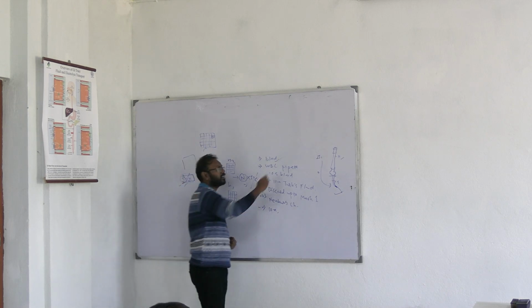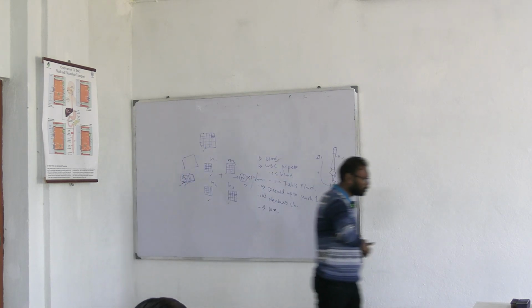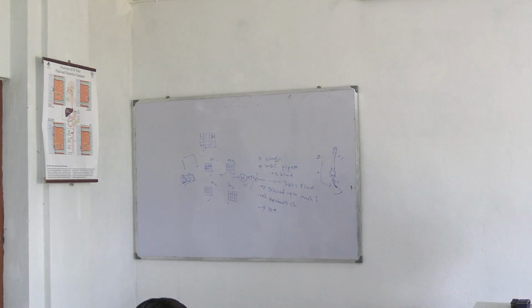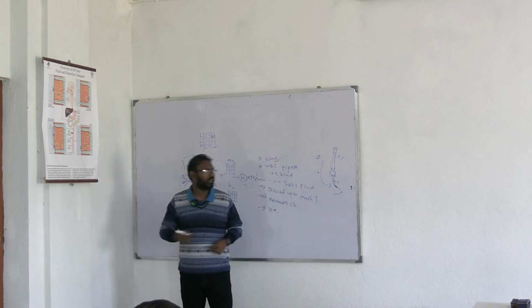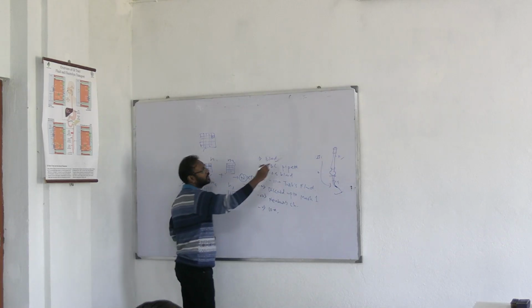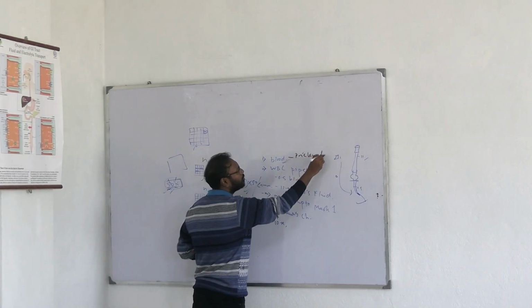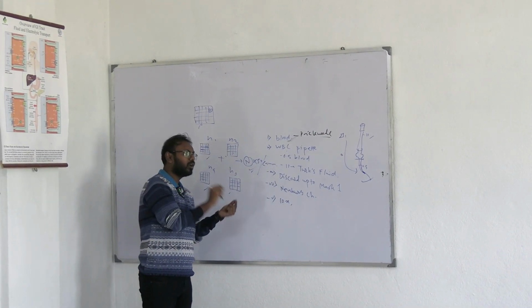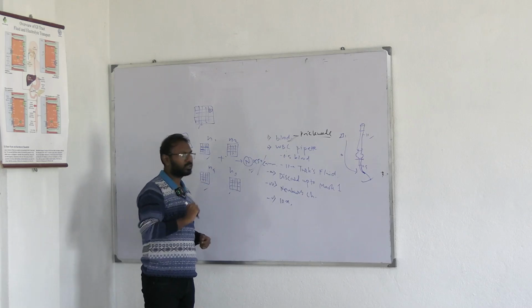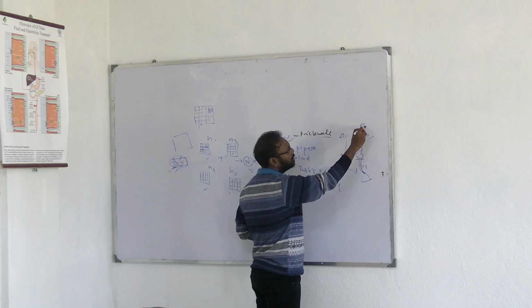First you need to take blood. Those who have done the classes already know the procedure to take blood and how to keep the process infection free and also sterile. Okay, you already know. So you will get a prick needle, by which you have to prick your finger. You have already done your hemoglobin, so you know how to prick and how to take the blood into the capillary. Okay, so here you will have pipettes.